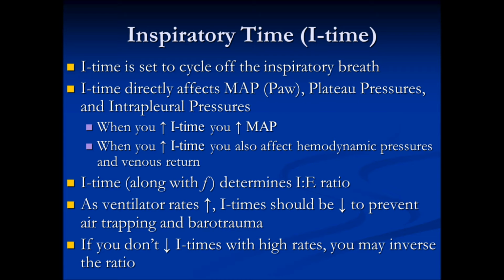So you have to be mindful when you have a patient on these neonatal vents, that if you have an opportunity to manipulate the rate knob, then you need to be mindful of your I time, because if you do not give the patient enough time to exhale all of that stuff that they just put in their lungs, then it could cause air trapping and barotrauma.